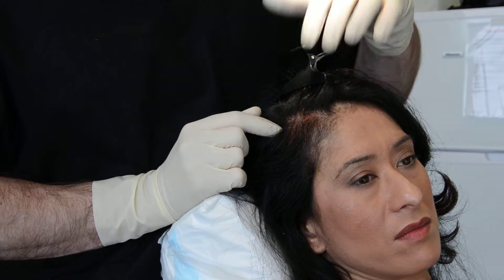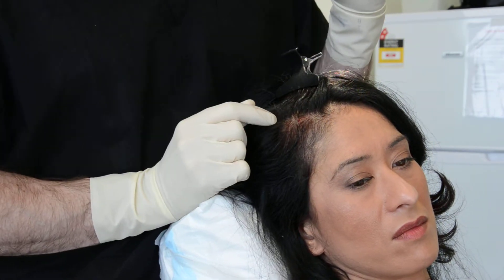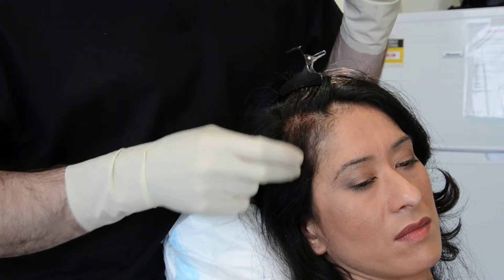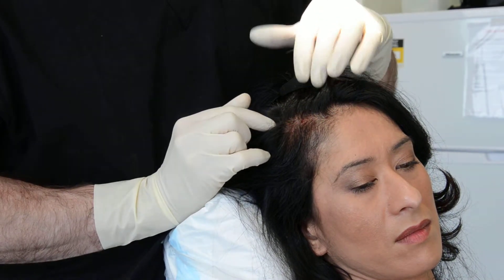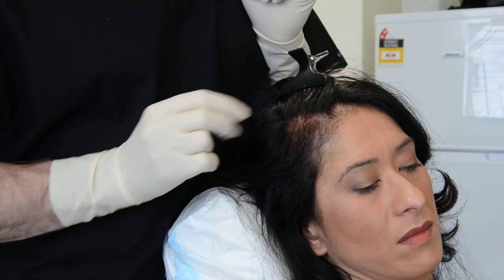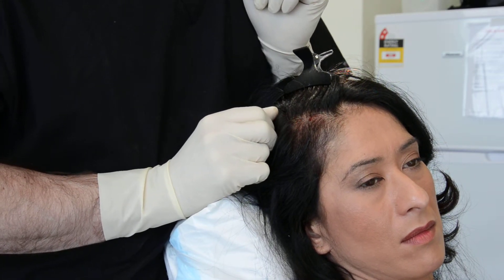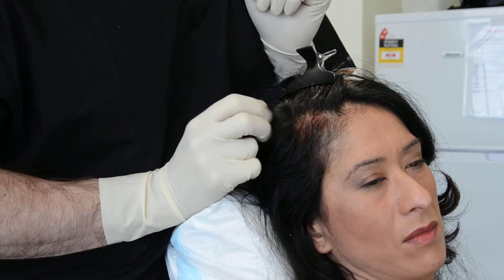There are different types of machines, and it's very important to understand the difference between them. You need to use a machine like the SmartPrep 2, which concentrates platelets at very high levels to ensure good results. Another important aspect is to stimulate the area with microneedling prior to PRP treatment, and also to activate the PRP prior to injection into the area.